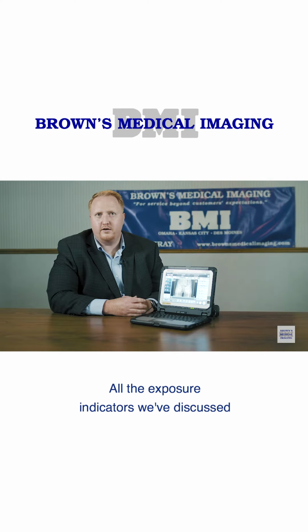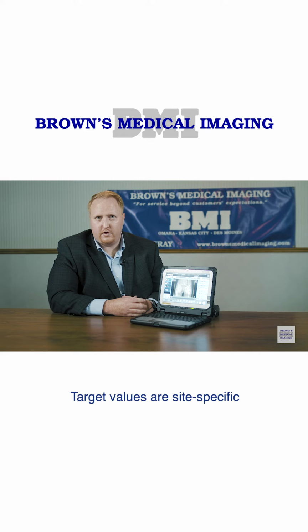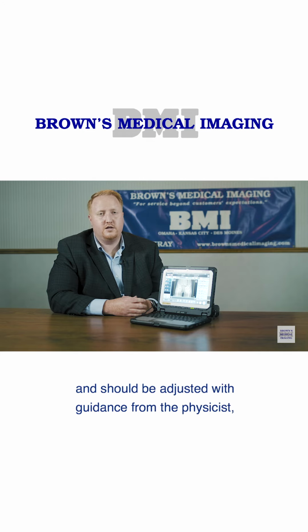All the exposure indicators we've discussed are useful tools. Target values are site-specific and should be adjusted with guidance from a physicist, radiologist, and your application specialist.